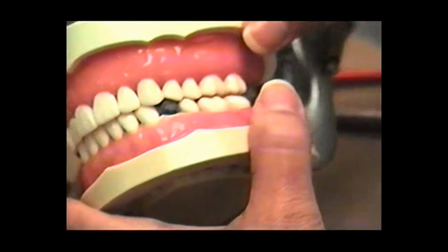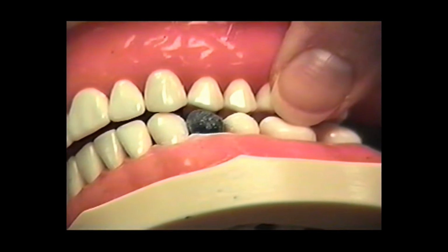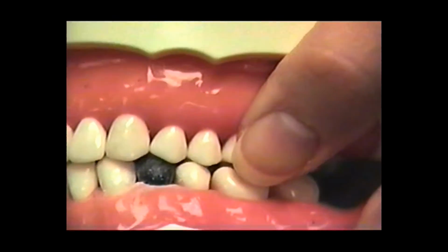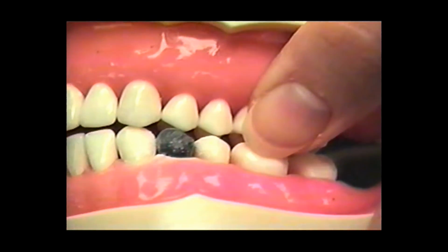What we can also do is check and see when the patient goes into lateral movements that we don't have a contact on our waxing. And this one does. I'll show you. Let me change the angle a little. There we go. You want canine guidance, right? There's your canine guidance.